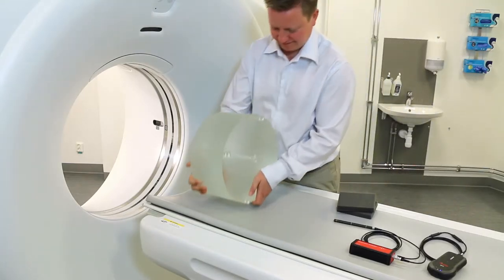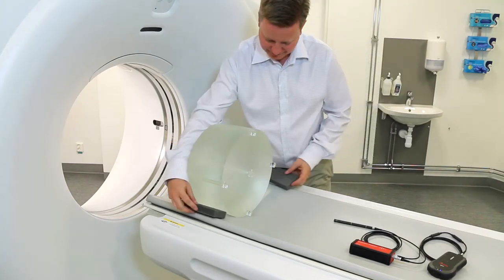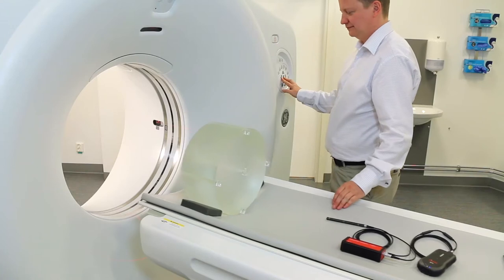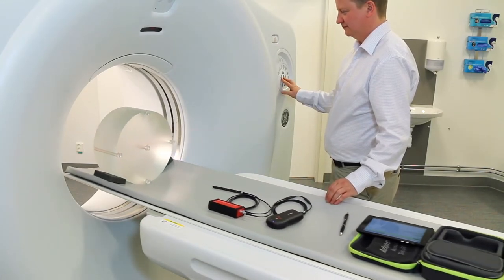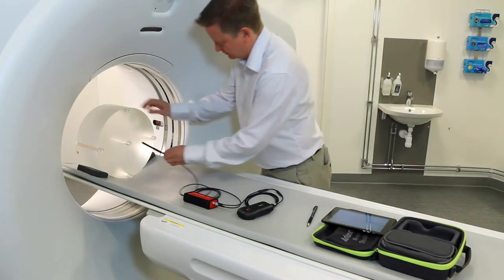Place the body phantom onto the patient table and fix it properly to prevent it from moving. Move the patient table and use the lasers to align the phantom to the centre of the gantry in the CT. Place the CT ion chamber in the centre hole of the phantom.